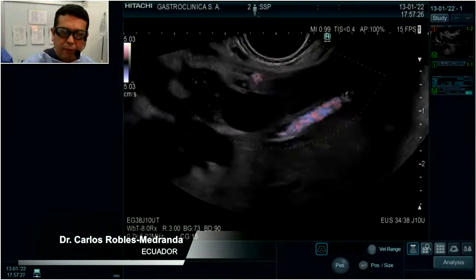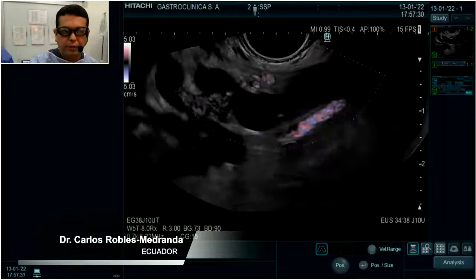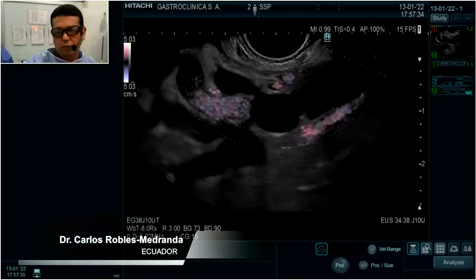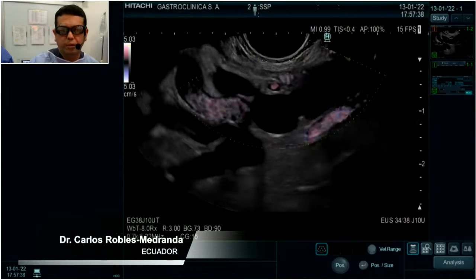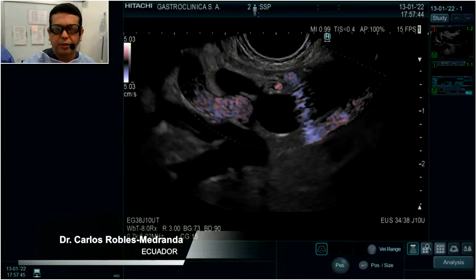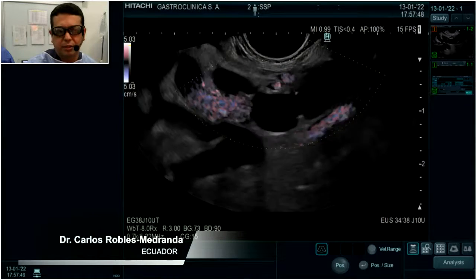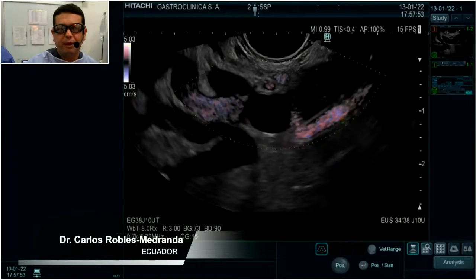And one of the big problems of this kind of surgery is to have a stenosis of the anastomosis. So I will try to show how to deal with this, guided by US, because we cannot perform any kind of treatment for the moment with ERCP. Until several years ago we had this kind of problem because we didn't have any other option.